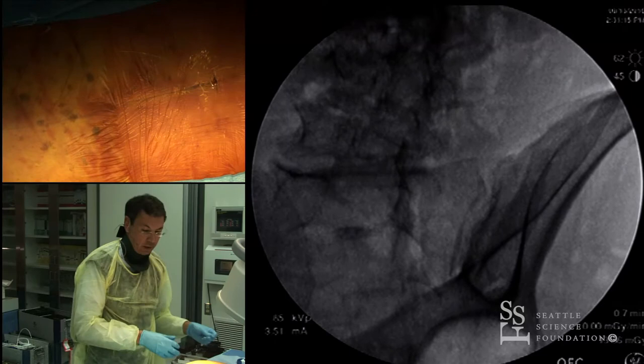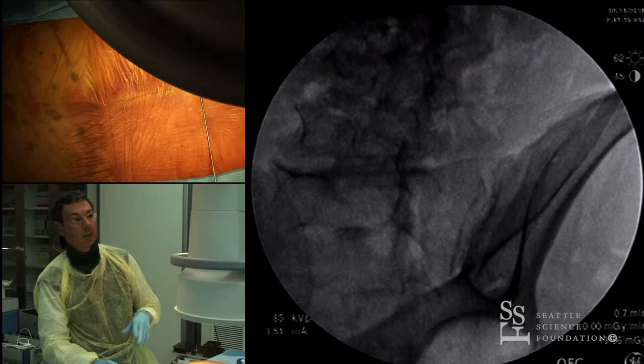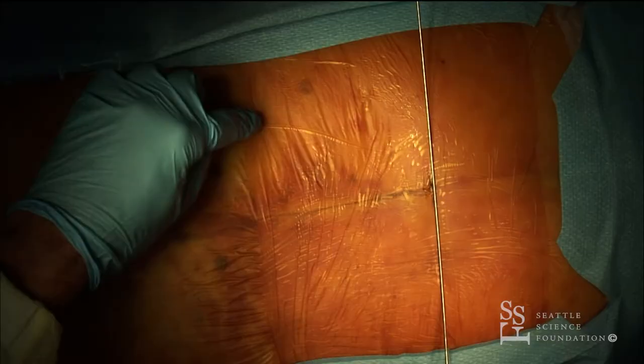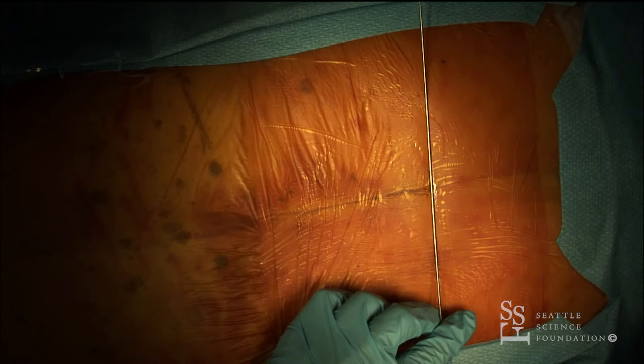Now let's try to do it on the specimen. Usually the best way to find the entry point is when you already have previous screws placed — you have multiple entry points and you're working from T10 to S1, so making the incision is straightforward. But let's say you don't have any of those incisions — where is the entry point?